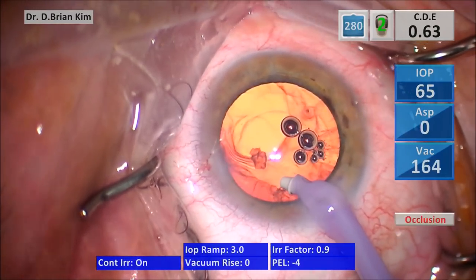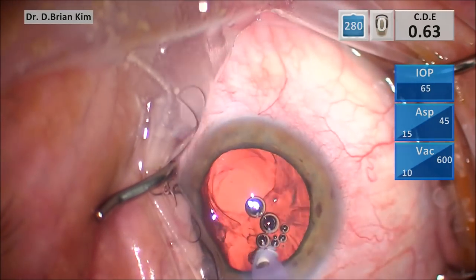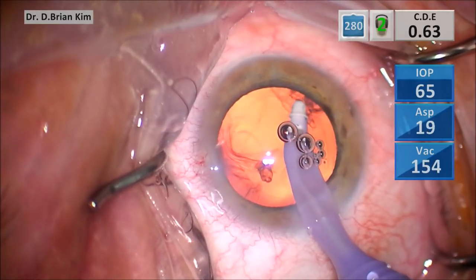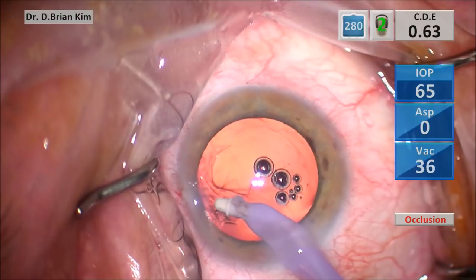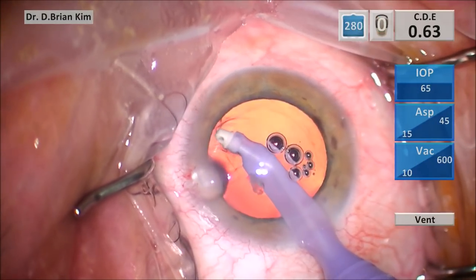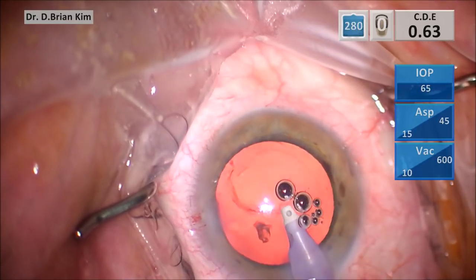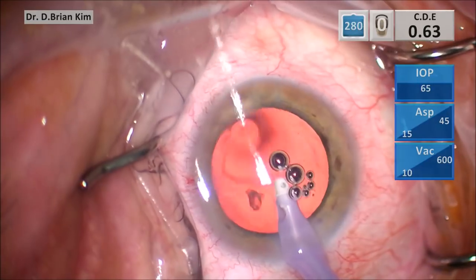And so I'm going to go at the lower flow, and you want to come right up to the edge of the cortex and gently apply the vacuum. And as you go right up to the edge of the cortex, it's able to remove the cortex very efficiently without removing any aqueous or surrounding viscoelastic. And right here, as I'm getting to this edge, I'm noticing as I got the vacuum up, nothing's happening. So then I realize this is vitreous now. So I have vitreous in my port, and so the hyaloid face is no longer intact.